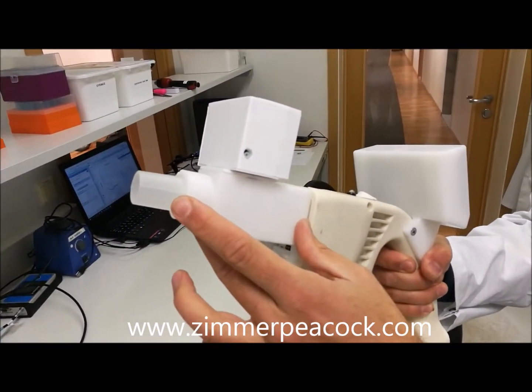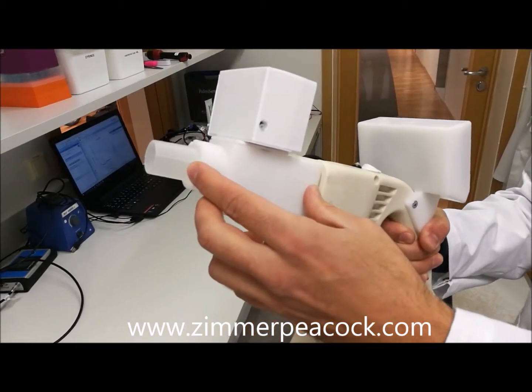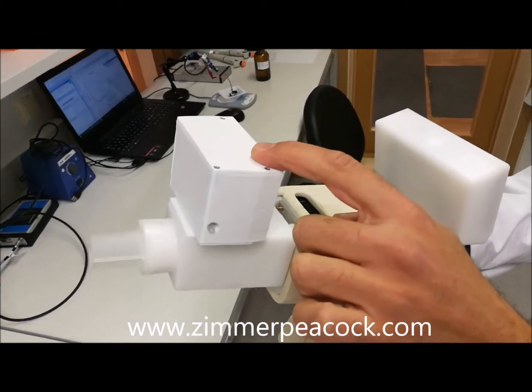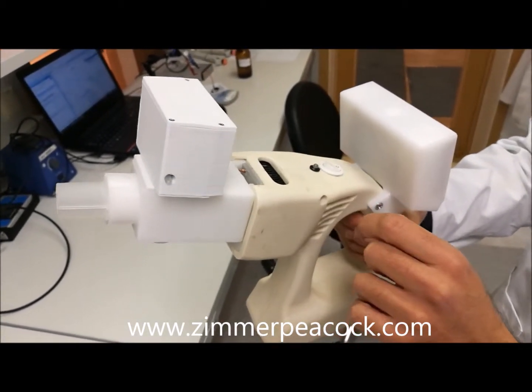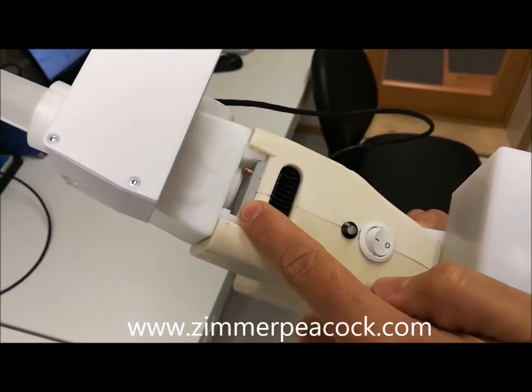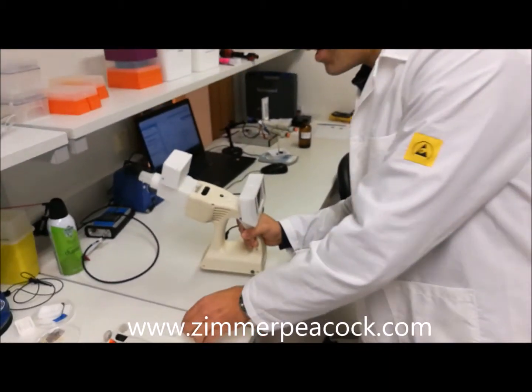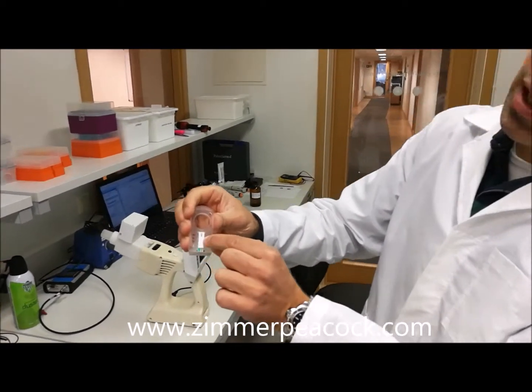After the mouthpiece you have a valve system that allows you to breathe in and out through the same mouthpiece. There are humidity and CO2 detector sensors on this part, and this is the interface. In this slot here is where the sensor cartridge goes.